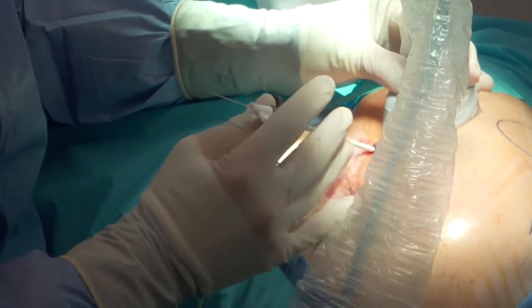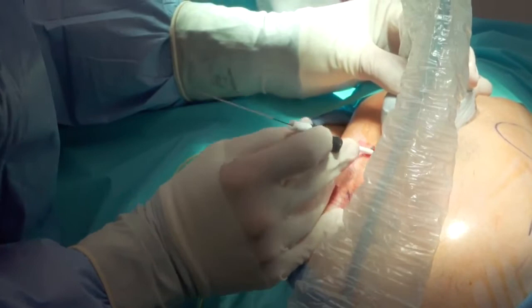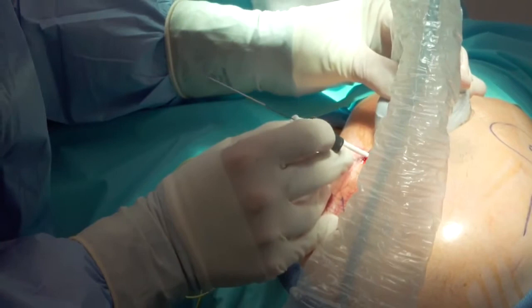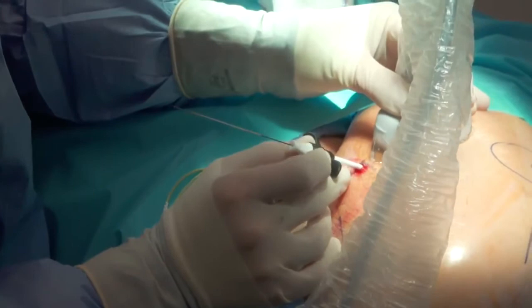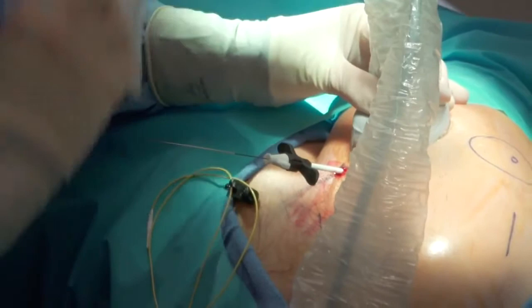So what I'm doing here is gently feeding this down, again under the ultrasound, making sure that the tip is just past. You okay, John? A little uncomfortable. Now again, how's your pain during this? Right there is where it is. Okay, coming back a little. Good job. You're doing great, John.